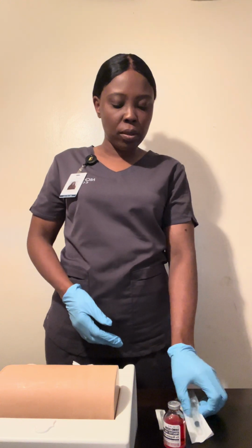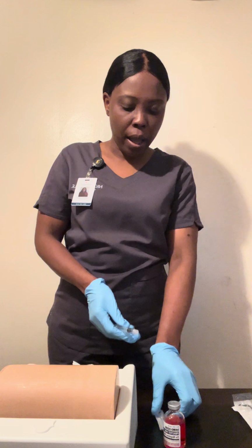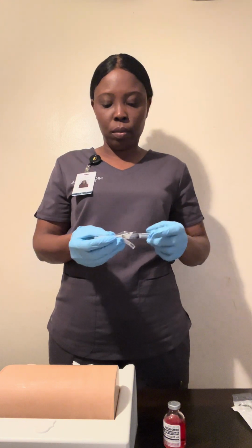Okay, Mr. Smith, now I'm gonna check my supplies. I have my vial and my 3 ml syringe, and then I have my 22 gauge 1-inch needle. I'm gonna attach them together.